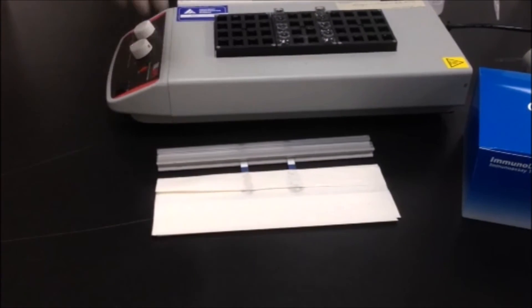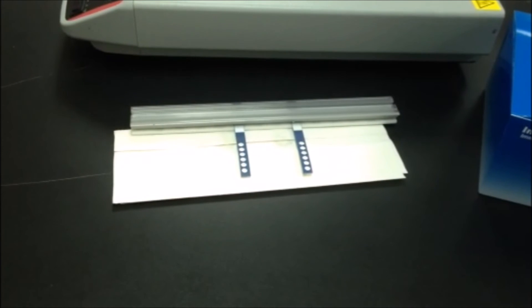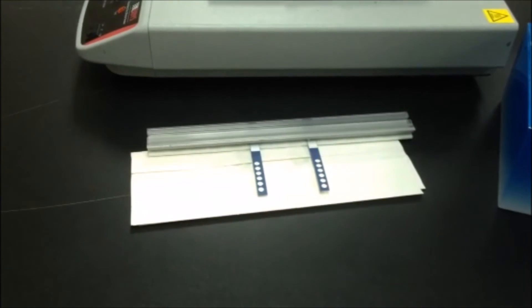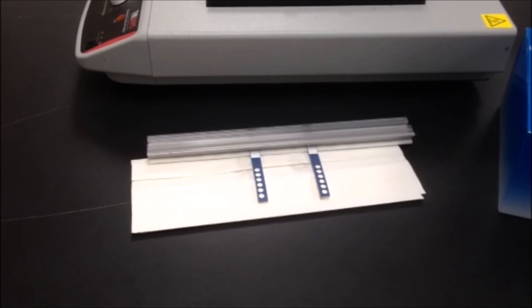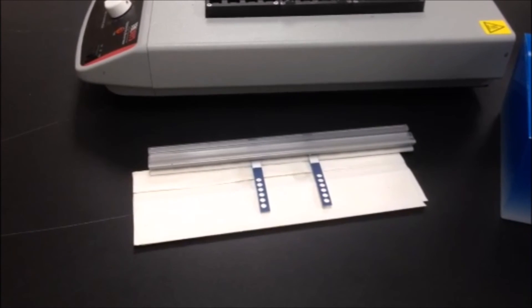After blotting dry and allowing a little dry time, read the assay strip. A positive is seen as an easily read blue dot. For assistance in interpreting a dot, please contact our technical services. GenBio has aids to interpretation since dot intensity relates to the amount and quality of the antibody binding to the reaction strip's spotted antigen, and may vary by patient just as it does in all immunoassays.